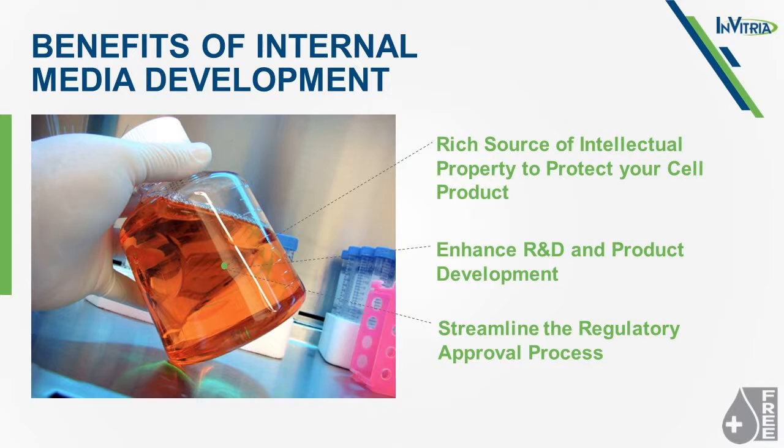However, if you're looking to completely remove FBS from your cell culture media and formulate your own custom blood-free chemically defined formulation, there are absolutely a few advantages over the reduced serum approach, in addition to the benefits that I've outlined earlier with the reduced serum. First and foremost, you're removing all undefined components from the cell culture system and replacing it with a media that is completely chemically defined. And what I mean by chemically defined is all of the components within that formulation are known.